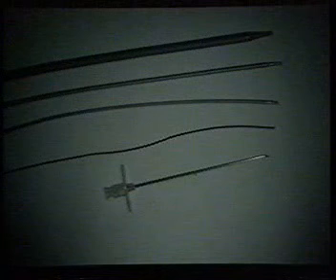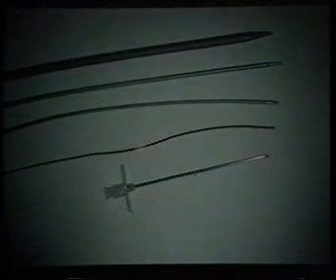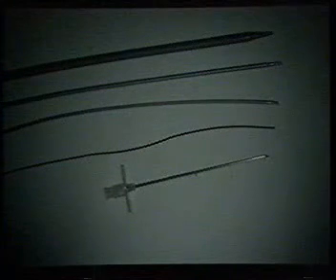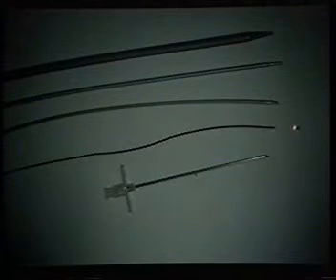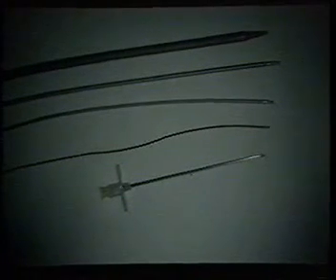When we are performing a drainage and we want to use a Seldinger technique, we use these materials seen here on these slides. Here is a typical Potts-Cournand angiography needle, which we commonly use to gain access to the pleural fluid collection. We use a floppy-tipped, long-length tapered 15-centimeter guide wire, and then we progressively dilate the tract in 2 French increments until we've reached the diameter of catheter that we want to place.